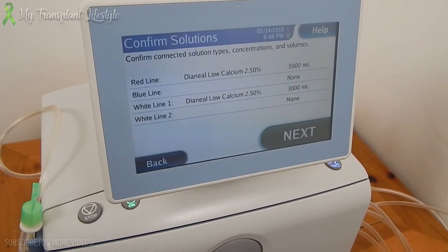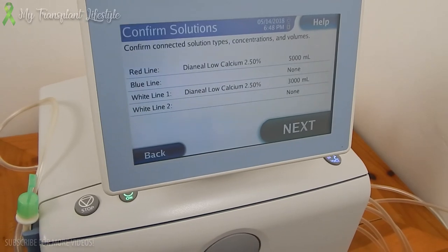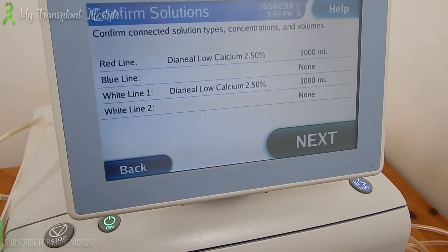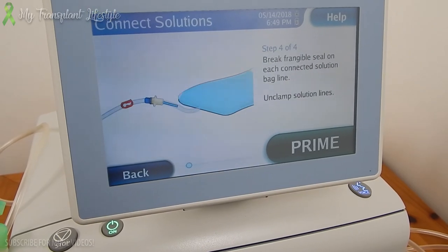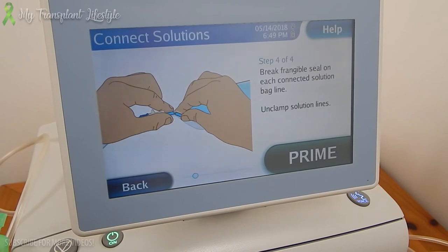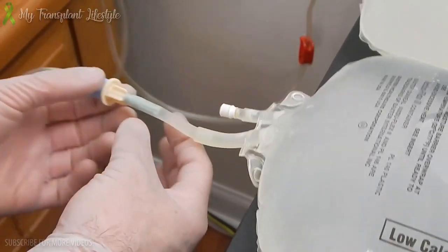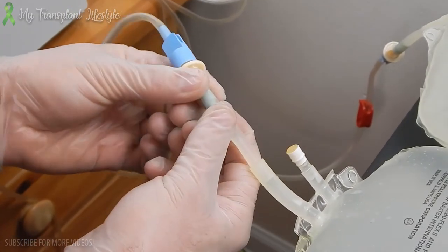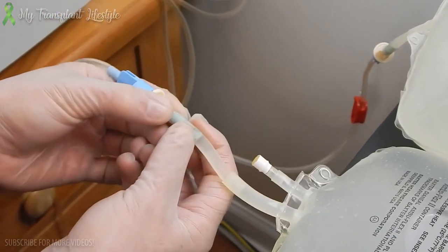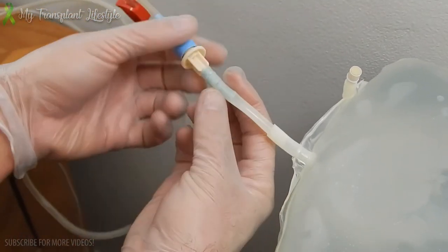Confirm connected solution types, concentrations, and volumes. When finished, touch next. Break frangible seal on each connected solution bag line, then unclamp solution lines. Break the frangible seal on the white clamp line, as well as the red clamp line.